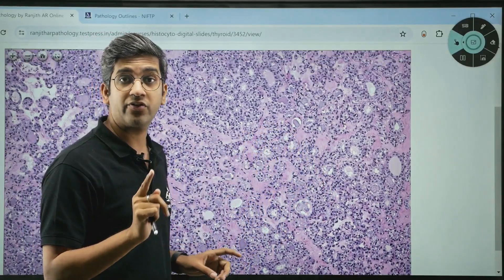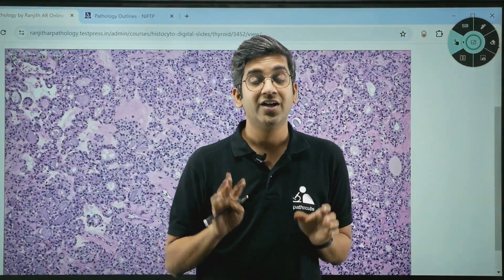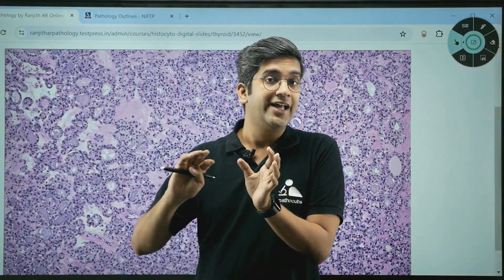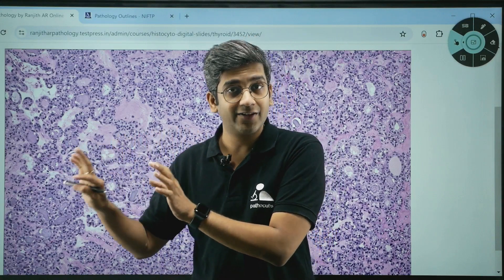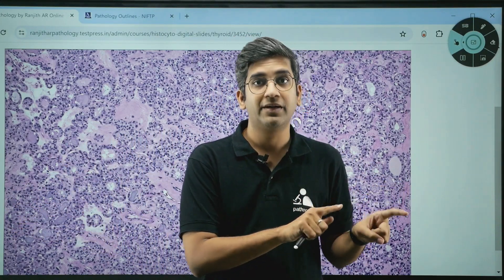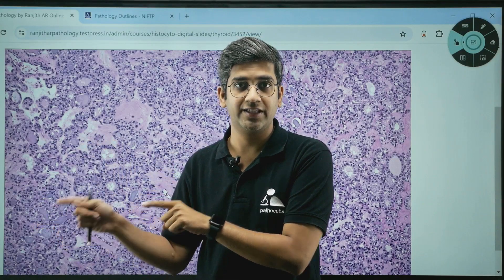The most important thing: you should not see psammoma bodies. Ultimately, I'm trying to say it's not a papillary thyroid carcinoma. It's a follicular neoplasm, but with papillary-like nuclear features.